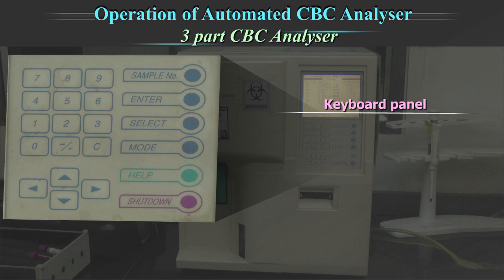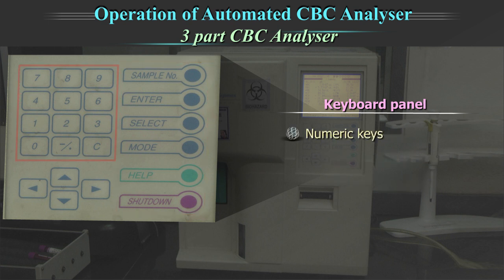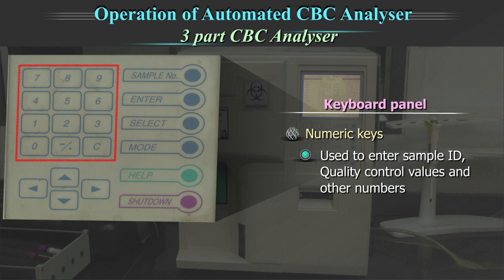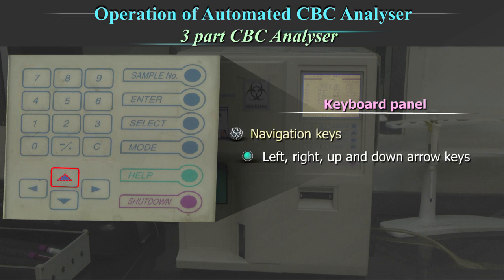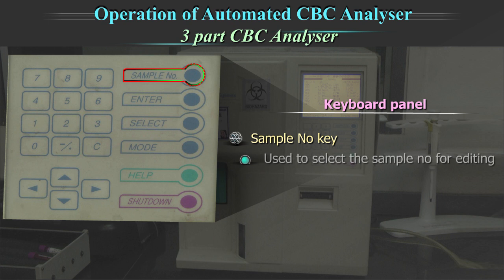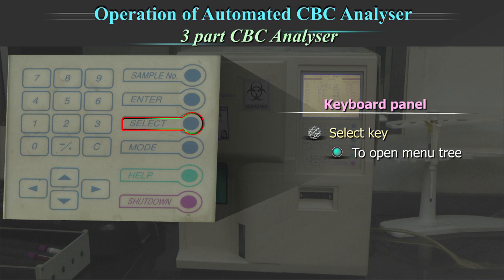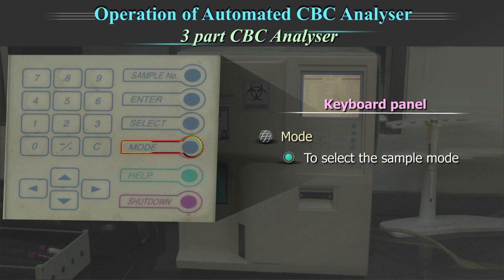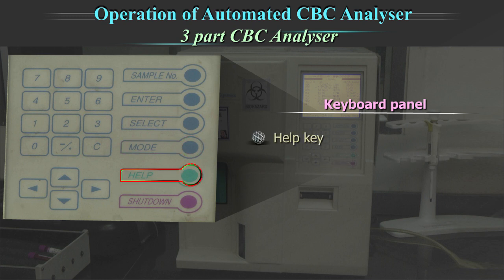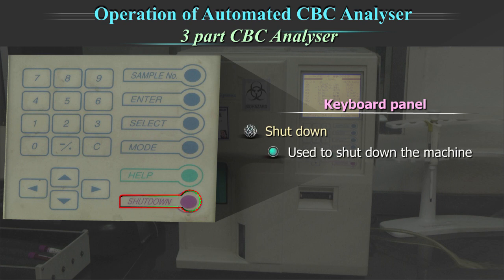The keyboard panel shows numeric keys, navigation keys and shortcut keys. Numeric keys are used to enter sample ID and quality control values. The navigation keys are used to navigate the equipment menu. The sample number key is used to select the sample number for editing. Enter is used to fix the selected menu. Select key helps you to open the menu tree for further options. Mode helps to select the sample mode — whole blood mode or pre-dilution mode. Help key is used when an error has occurred. Shutdown is used to shut down the machine.